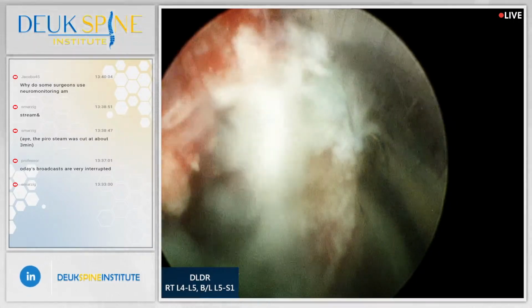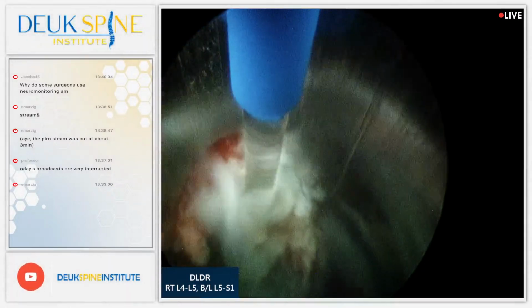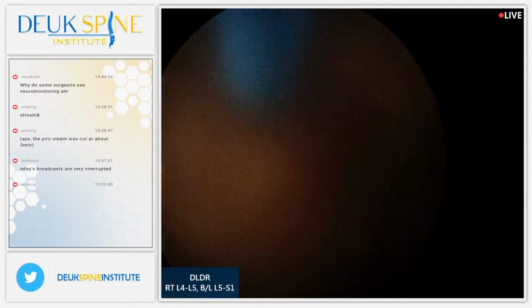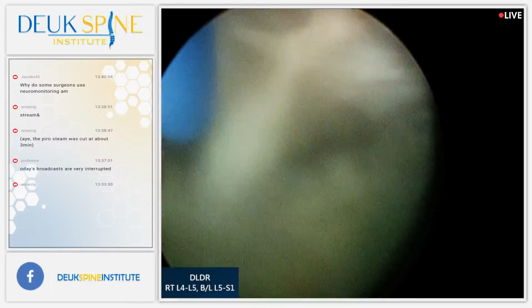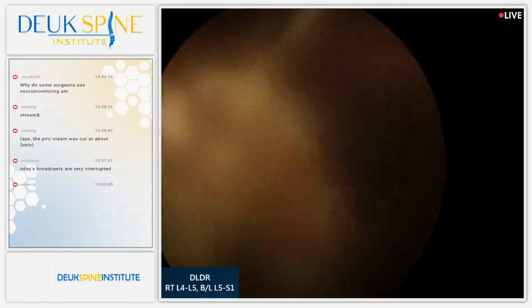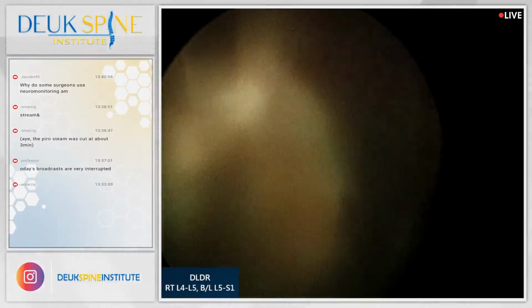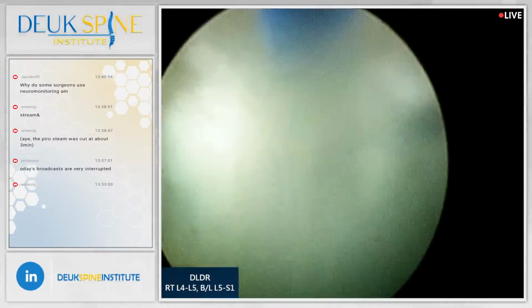Any questions? Yes, we have a question coming from Jacobo45 once more on YouTube, asking, why do some surgeons use neuromonitoring? Yeah, neuromonitoring is used for certain types of procedures. I use it as well, usually for fusion. If you're going to put in screws into the pedicles around the nerve roots, then you should use neuromonitoring. The reason is you want to see if you're damaging the nerve while you're putting in the screws.